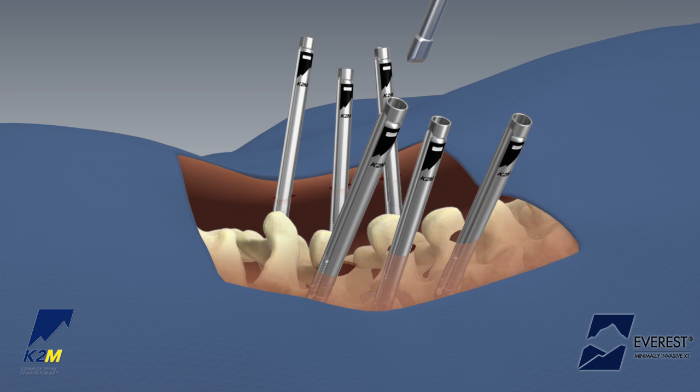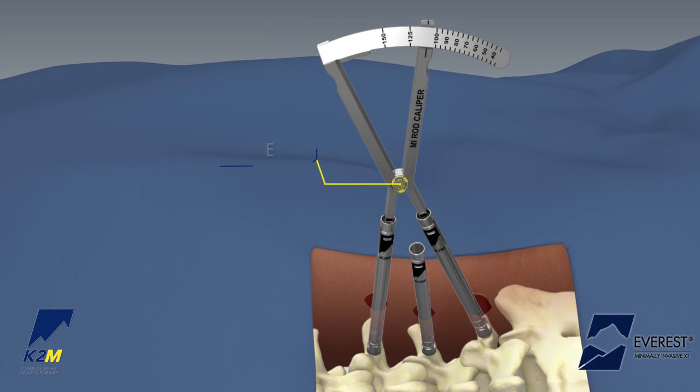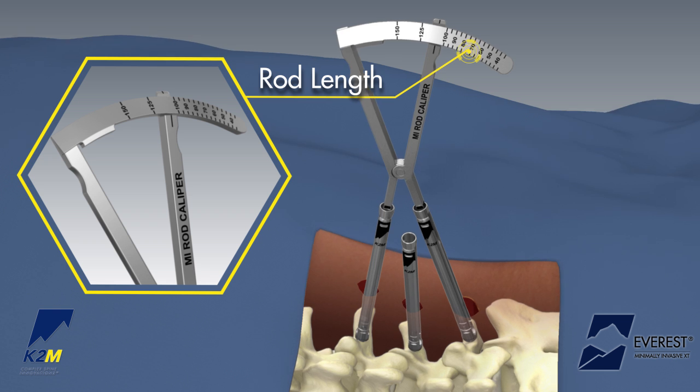Prior to rod insertion, attach the alignment tool to a palm or T-handle while in a fixed position to align the screw heads. Place the long MI rod calipers into the most cranial and caudal screw housing to determine the appropriate rod length.